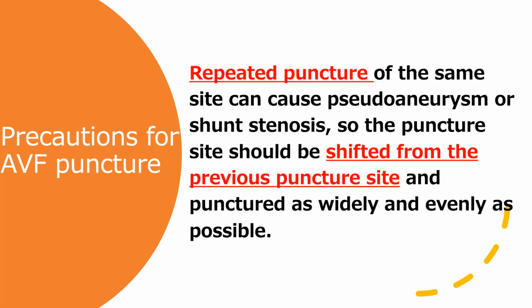In AVF, repeated puncture of the same site can cause pseudoaneurysm or shunt stenosis. So the puncture site should be shifted from the previous puncture site and the puncture should be performed as widely and evenly as possible.